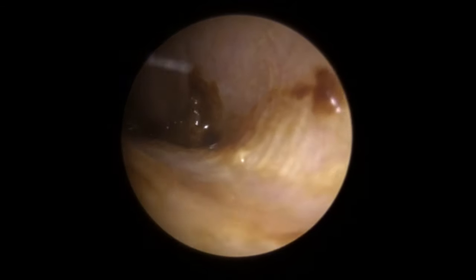So enough praising you guys — let's get back to the wax. You can see now we've got the last little bit coming away. I just want to clear this — we've got this flap of skin that's lifting up, so we've got that away now. Getting this very last piece now — just slowly edging down towards it. I've slowed the video down — you saw it suck towards the suction tube. And we'll just take this last little bit away there. There we go — out it comes. And the eardrum there looking good. Perfect. So this is what we removed — seven and a half centimetres, just bang on three inches. You can see really big pieces there to the right-hand side, really, really long pieces.